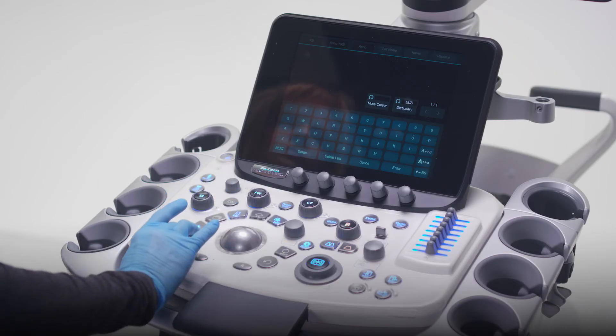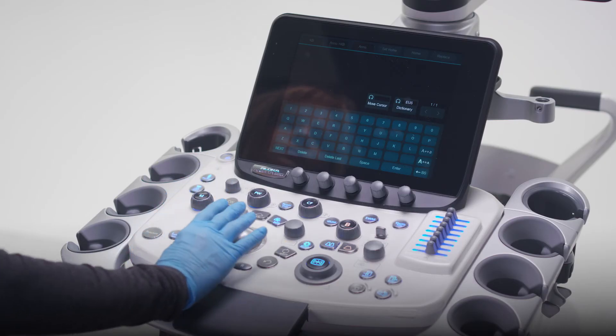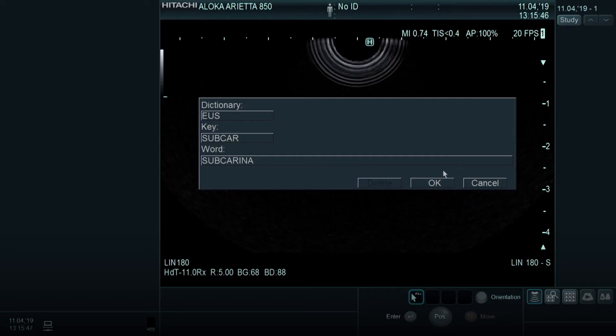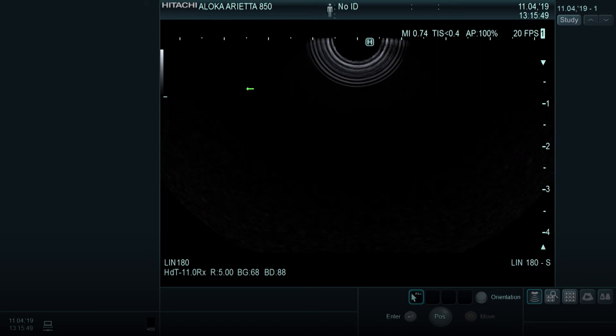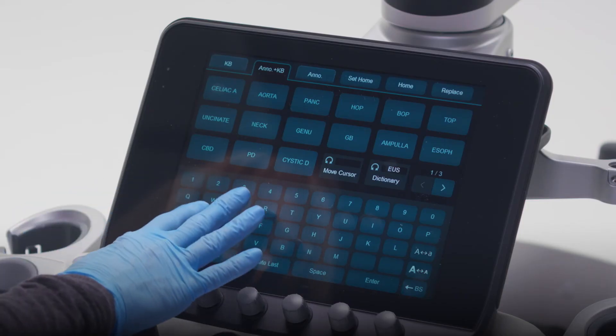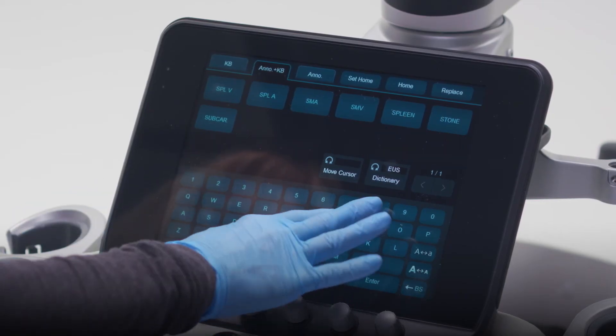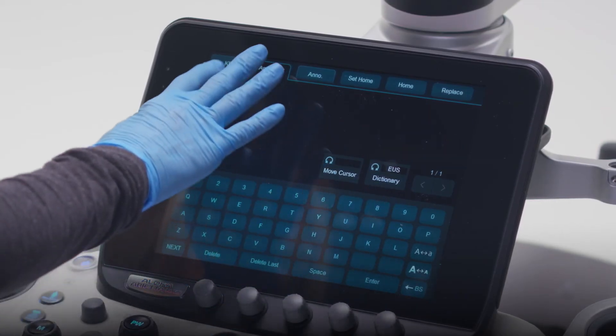Click the Enter key again and then use the trackball to move the cursor to click OK. You can now find the word you added in the dictionary.